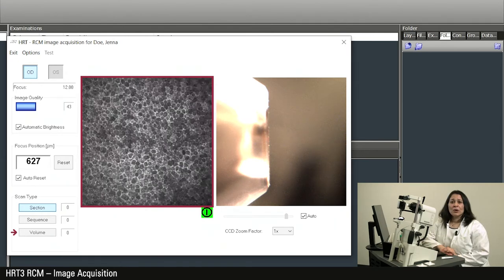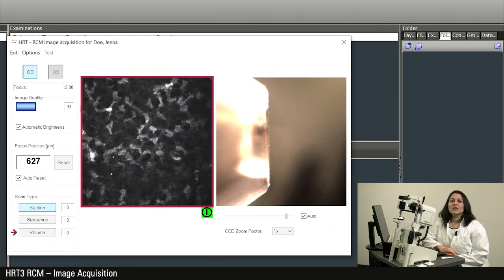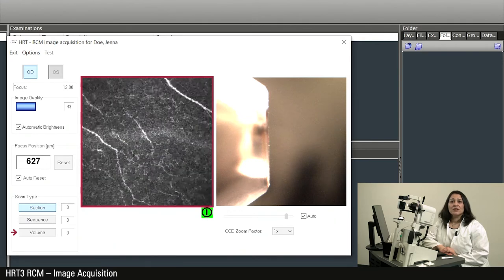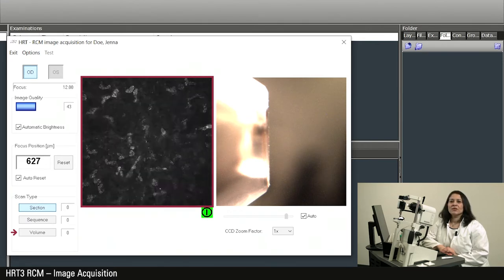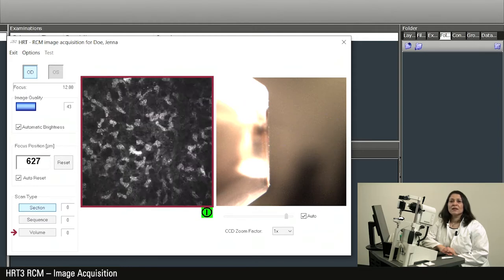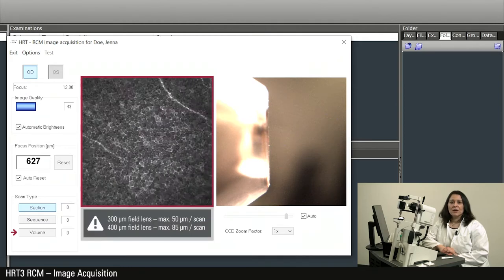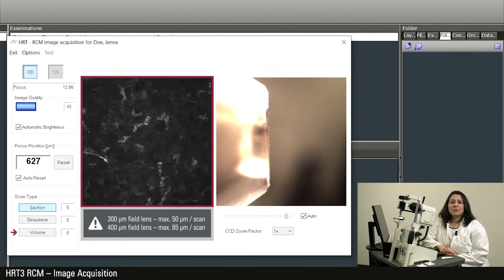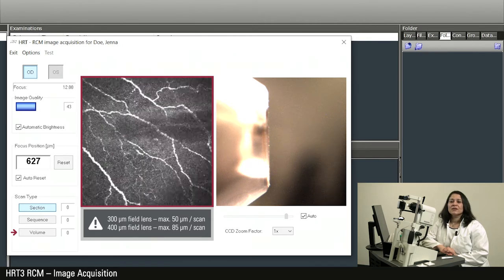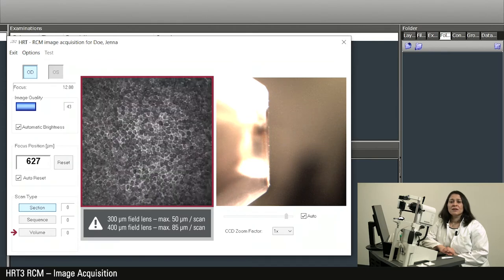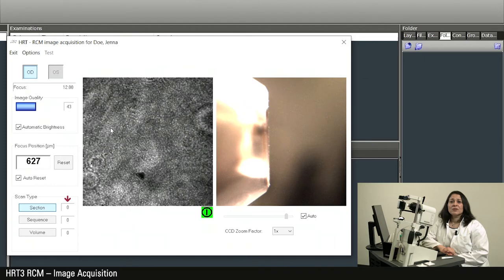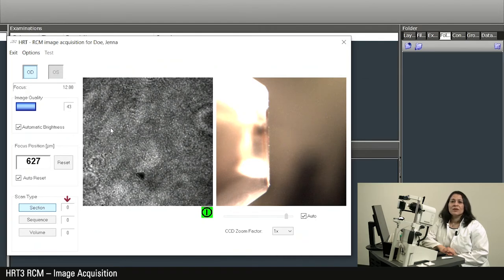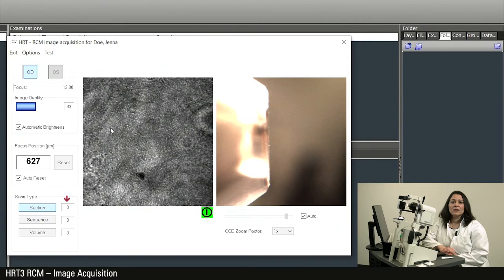With the volume option, the scan starts at a specific depth after the acquisition button is pushed. A series of 40 images is acquired during which automatic depth adjustment takes place. The depth of the volume scan depends on the field lens used. With a 300 micrometer field lens, a maximum depth of 50 micrometers per scan is achieved. With a 400 micrometer field lens, the depth is 85 micrometers. The number displayed next to the scan type button corresponds to the number of scans that have already been acquired and stored.